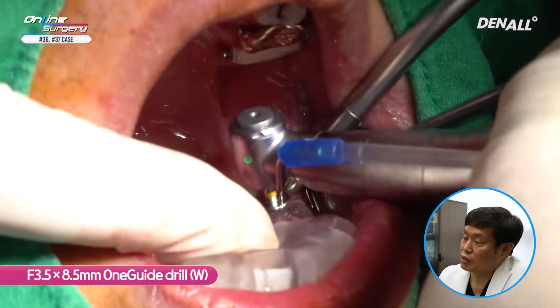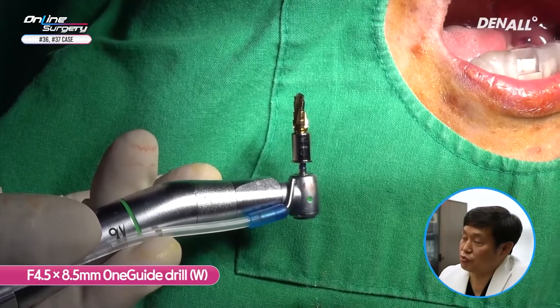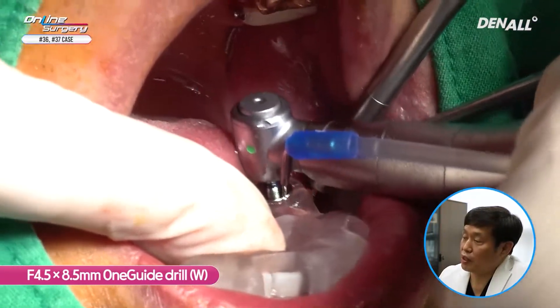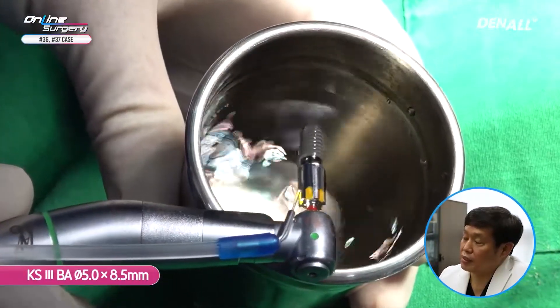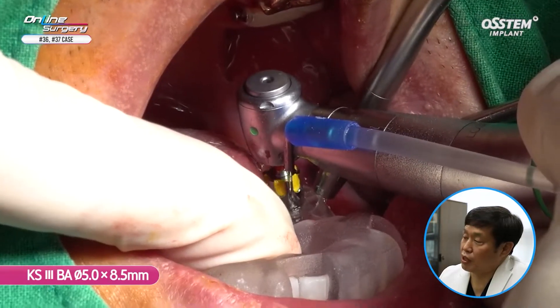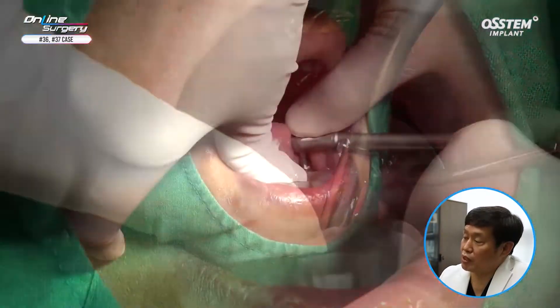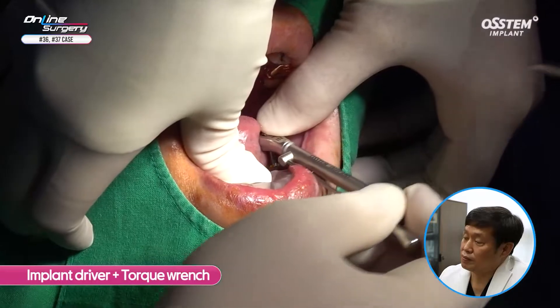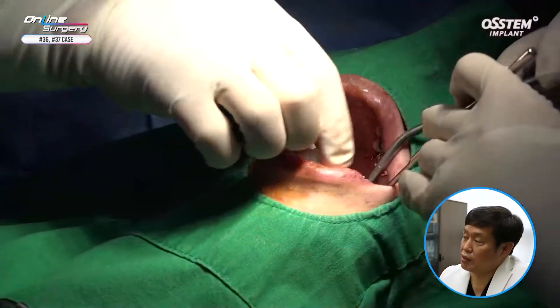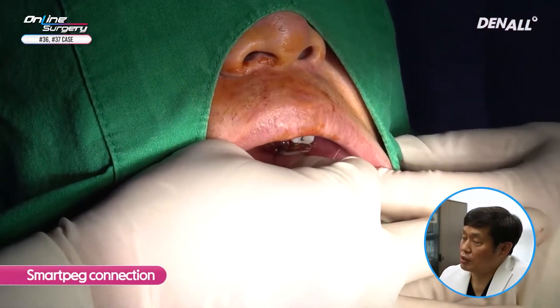For number 37, a 3.5 x 8.5 one guide drill is used. As mentioned, primary stability in number 36 was not as good as anticipated. Therefore, for number 37, I'm not going to do final drilling at 5.0 — instead, I'll use a 4.5 x 8.5 one guide drill for final drilling, drilling only up to 4.5. A KS3 BA 5.0 x 8.5 implant is placed after irrigating sufficiently with saline. The primary stability seems much better than number 36, and after using the implant driver and torque wrench, it is confirmed over 30 Nm. Placement position is then determined.